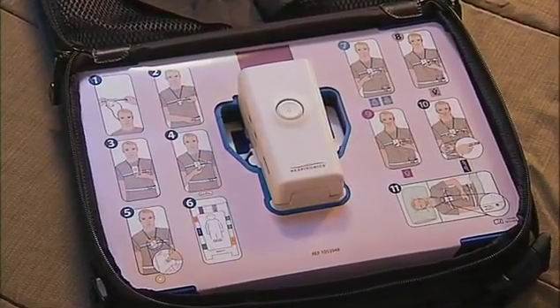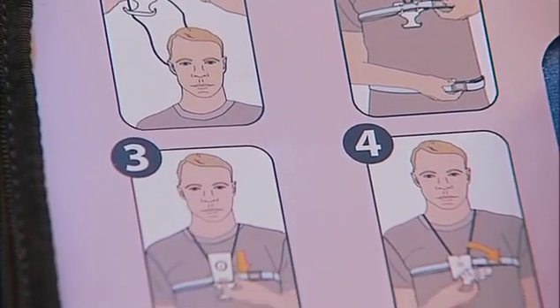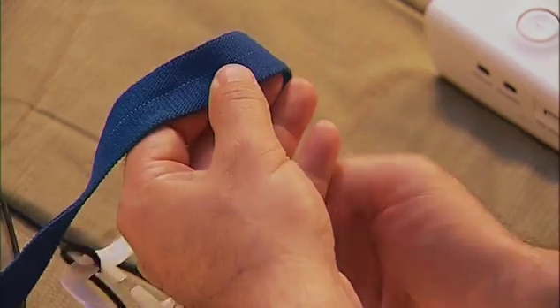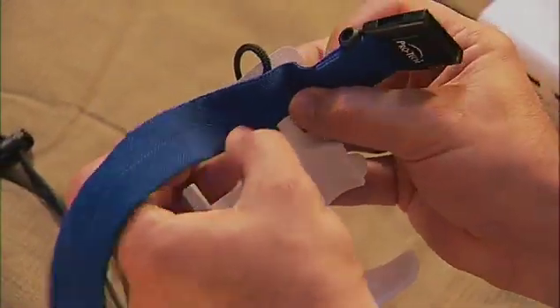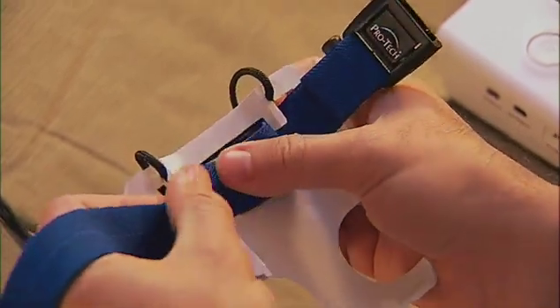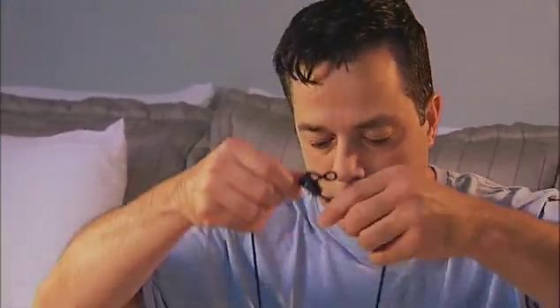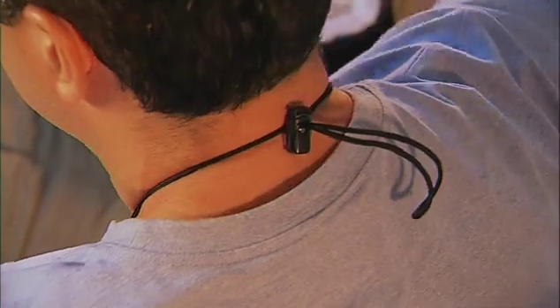Let's begin assembling the device. For reference, you can also refer to the sequence of instructions on the color-coded diagram located in the device case. First, check to see if the blue chest effort belt is already in place. If it isn't, slide it through the slots in the holder going from front to back. Place the lanyard over your head and around your neck.